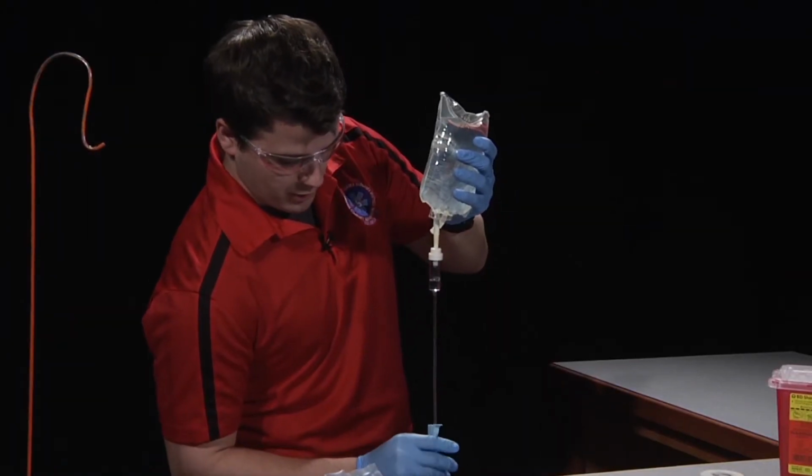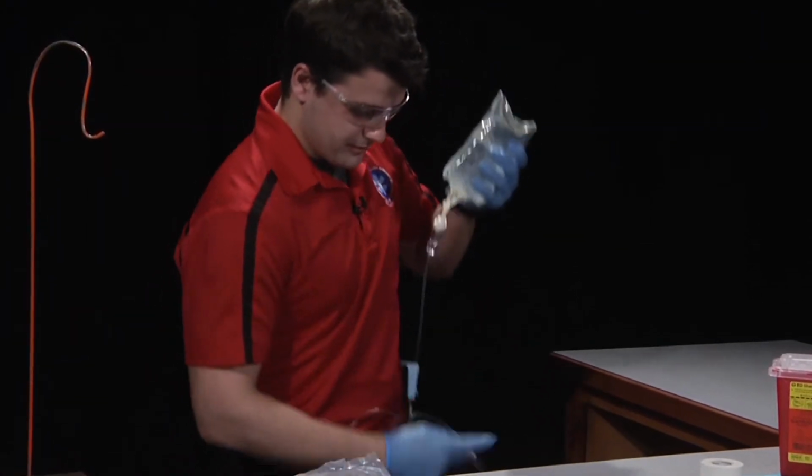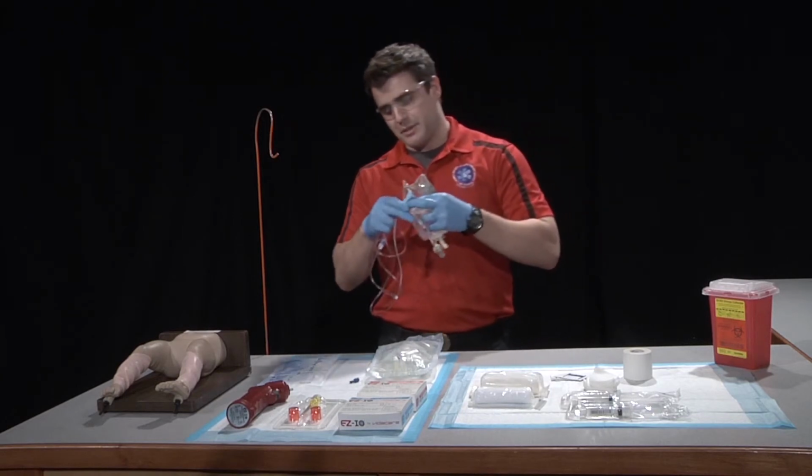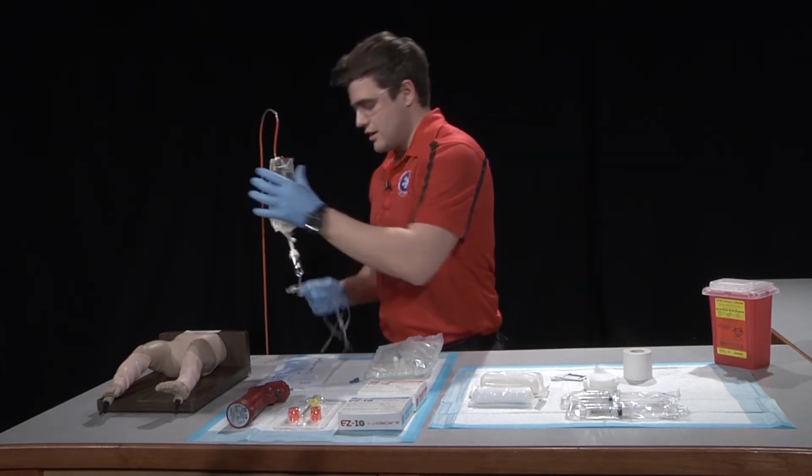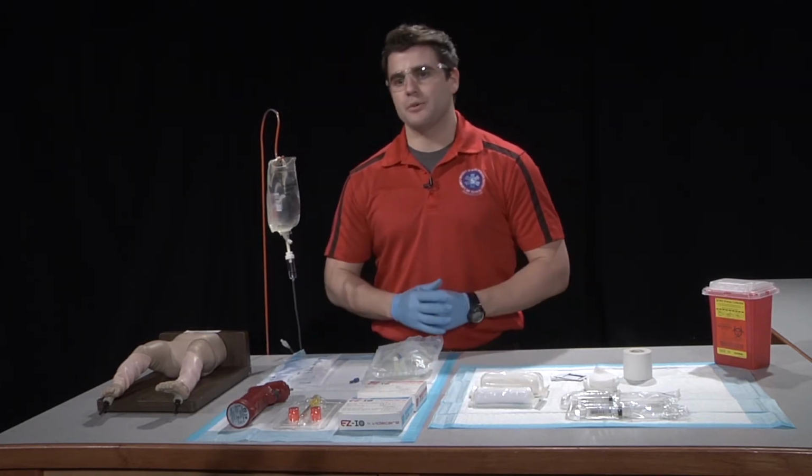Once all air has been purged, we'll close the flow clamp, reattach the administration set to itself, hang our bag, and prepare for using the IO.